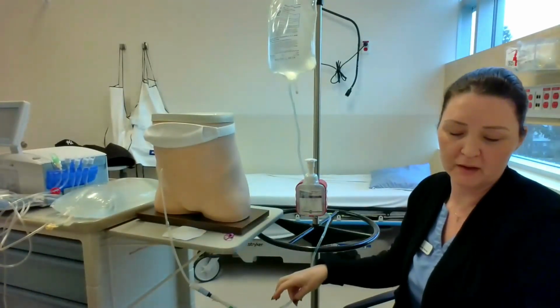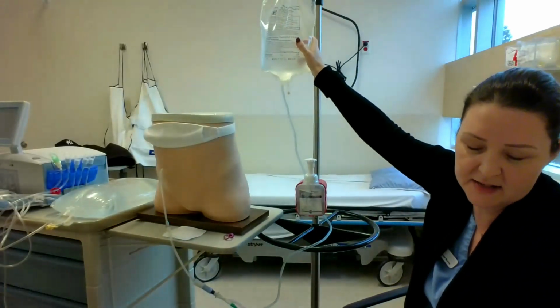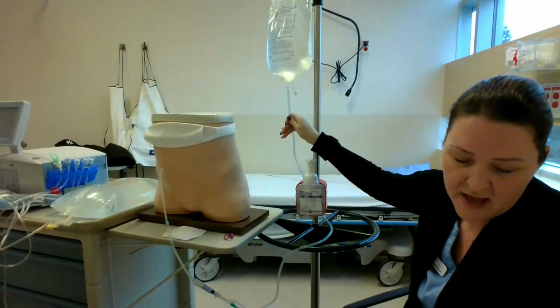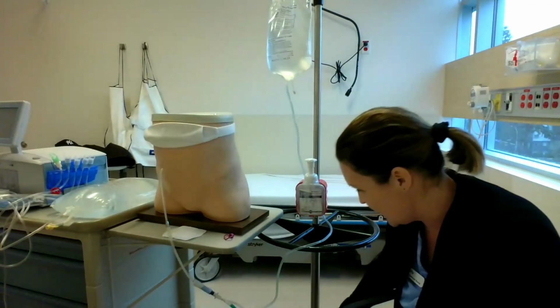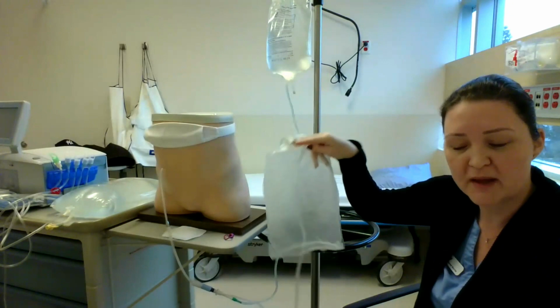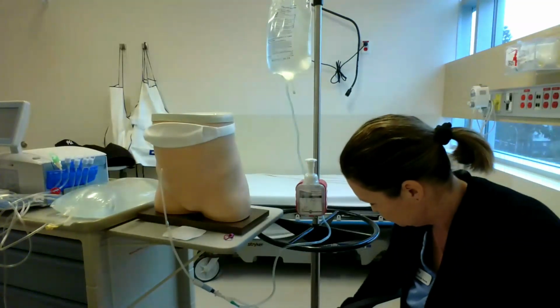So first you will fill with the PD solution, which is called dialysate. You'll let it dwell for 4 to 5 hours. And then after that, you will have a drain bag, which is attached, it's at the bottom. And that will drain all the waste and the water, okay? So it can be removed.